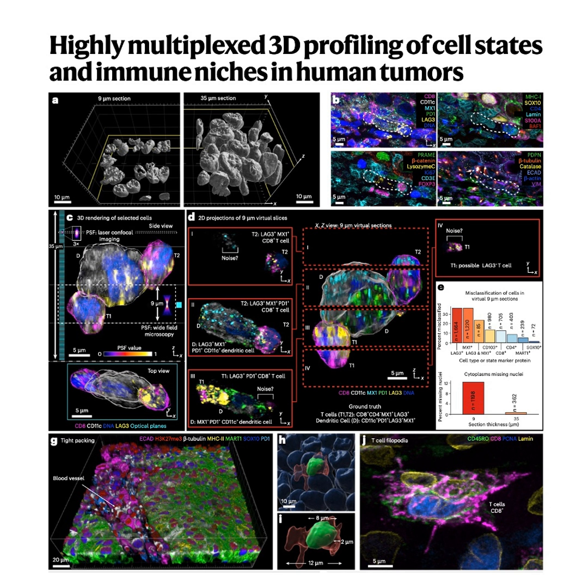If 95% of the potential information is just garbage, or at least incomplete, what are the real-world consequences? Like, if I'm a pathologist or a researcher looking at a slide, how am I supposed to know if, say, the absence of a key protein signal is real biology or just an artifact because the cell got chopped up? That's exactly the problem. That lack of ground truth, not knowing if what you see is real, leads to severe consequences. Probably the most notable is what you just touched on, erroneous cell type assignment, or phenotyping as we call it. They found errors in up to 40% of cells. 40% misidentified. How does that happen?